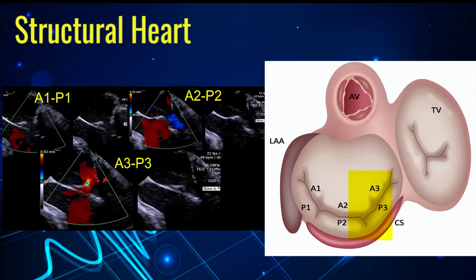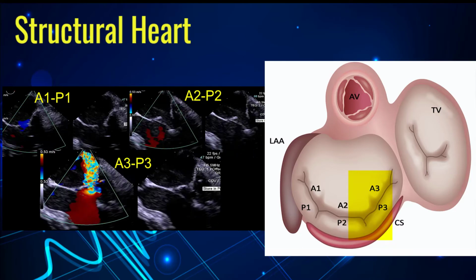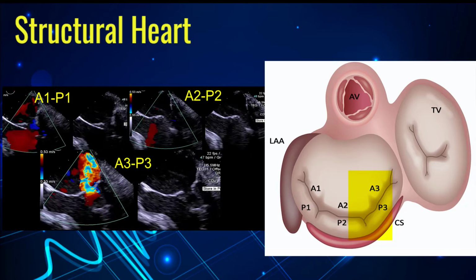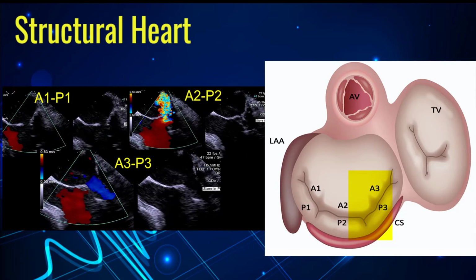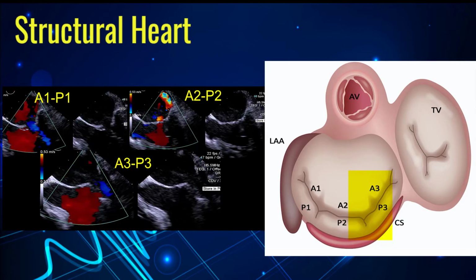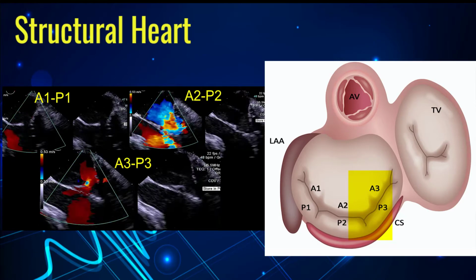Yeah. And just going back to your point, when we look at a 2D examination, we make a lot of assumptions that we're in the correct plane. So I think this all needs to be confirmed, and this is where the value of 3D comes in to precisely locate. So I think the next step is to do a 3D examination of this patient.